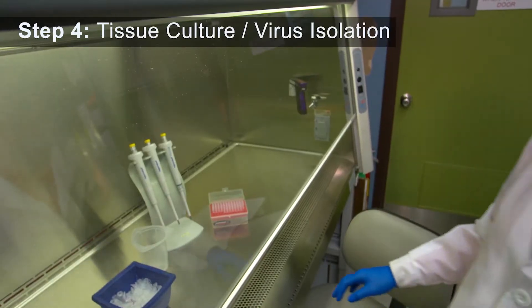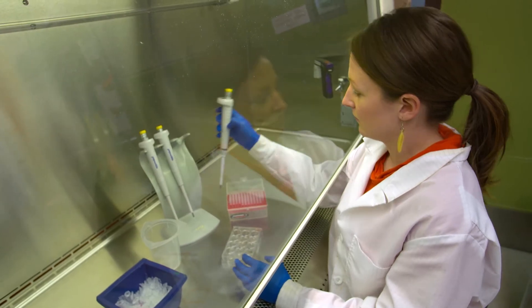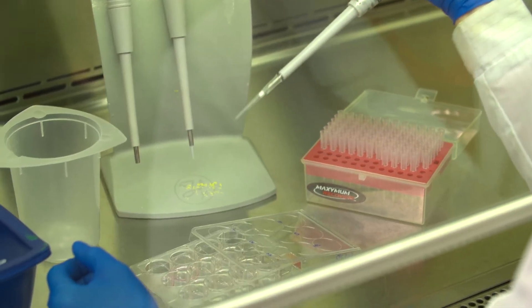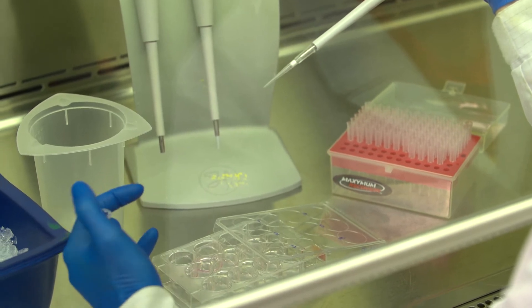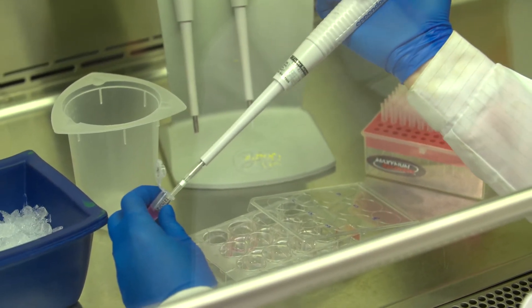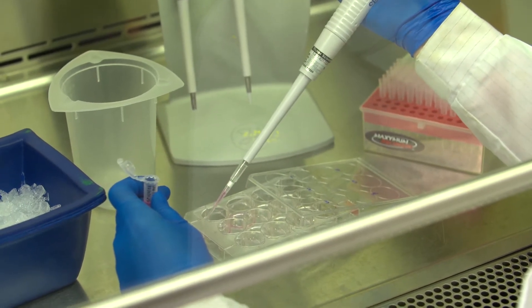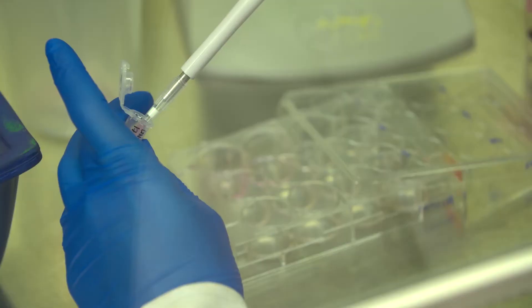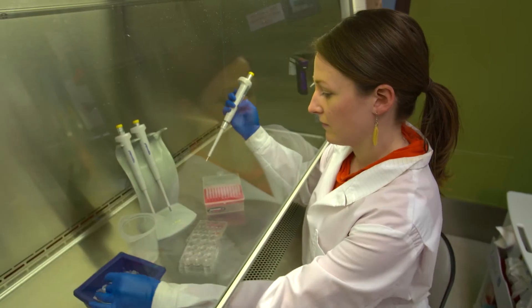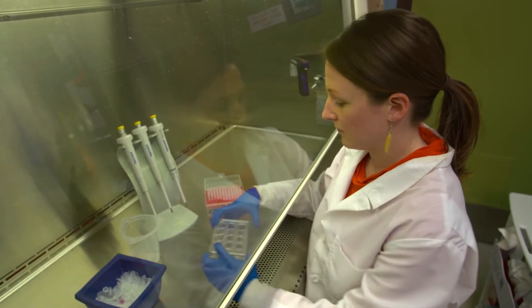Here we see a process called virus isolation in cell culture. A plate is used that has multiple wells of cultured tissue growing on the bottom. This cultured tissue is susceptible to live virus particles. The processed fish sample is added to each well using a pipette. Specific changes in the cultured tissue will allow us to determine if live virus is present in our fish sample.